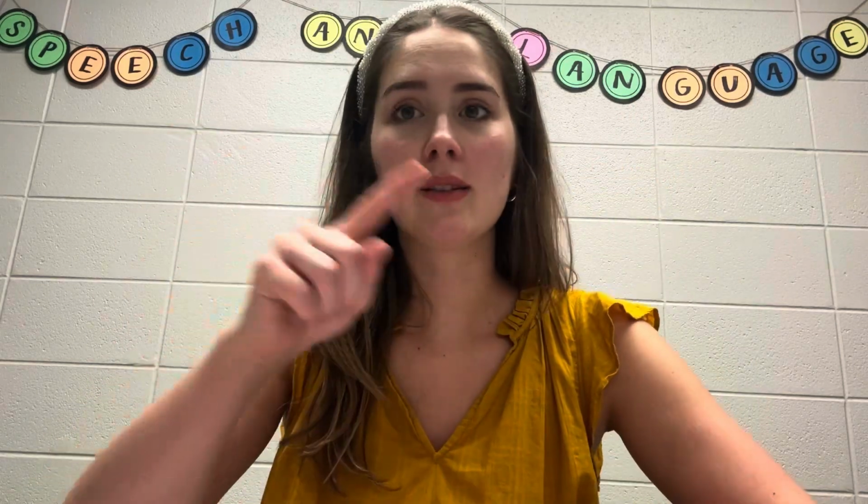And so that mimics the way that we form speech sounds and communicate with everybody. It's going to be the same exact motor plan every single time. You don't have to worry about accessing a word in a different way because it'll always be the same, just like how forming speech sounds is always the same. And now we're going to get into a little bit of how to use the device.